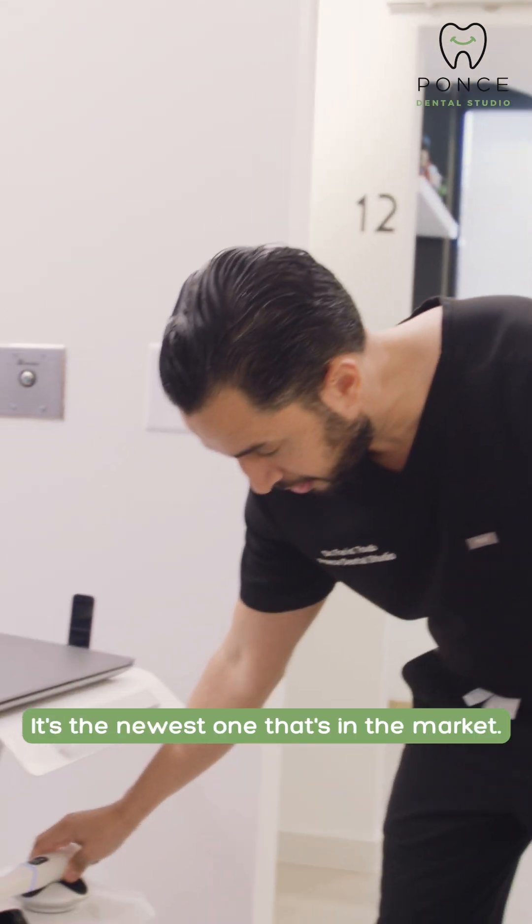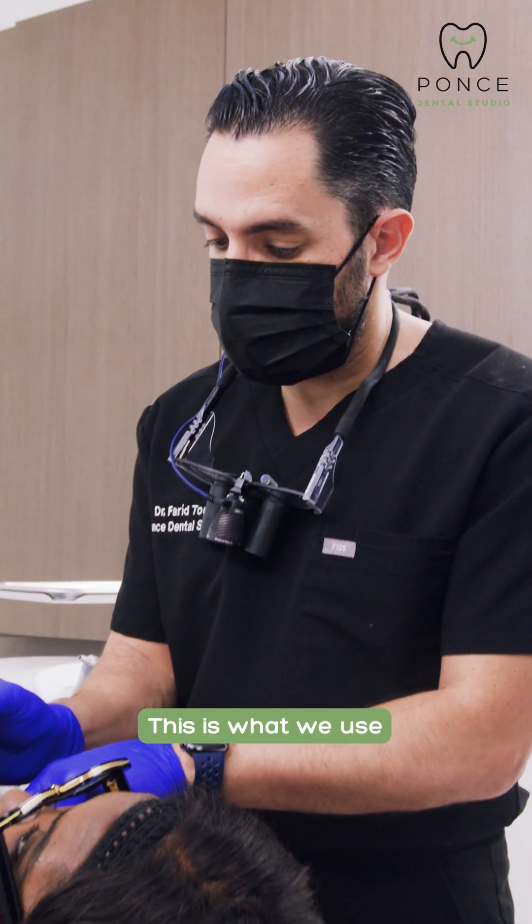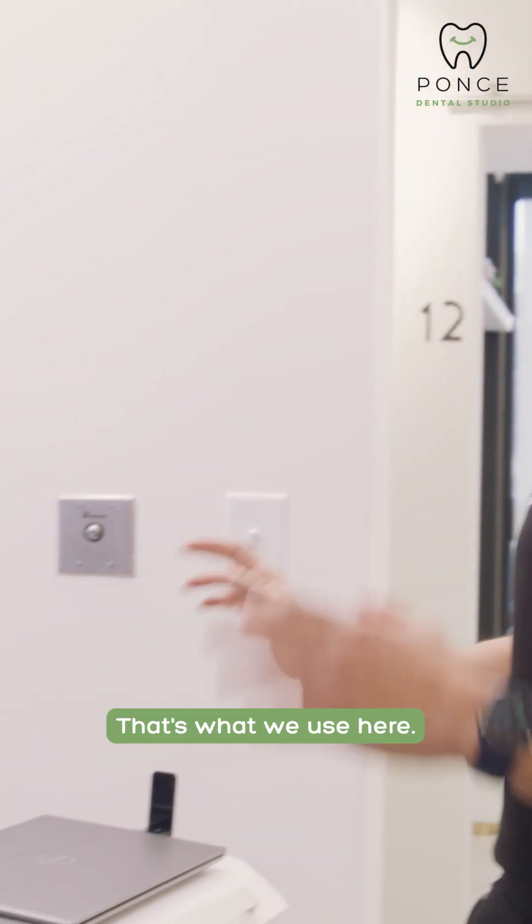So this is the Trios scan. It's the newest one that's on the market. And this is our iTero scanner. This is what we use for some surgeries and for any Invisalign procedures that we do in the office.